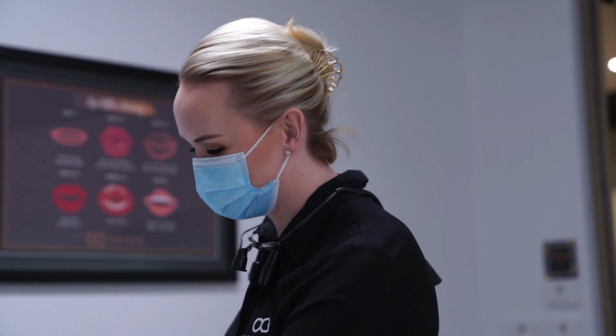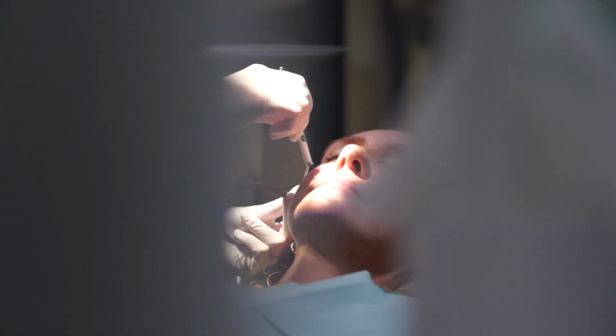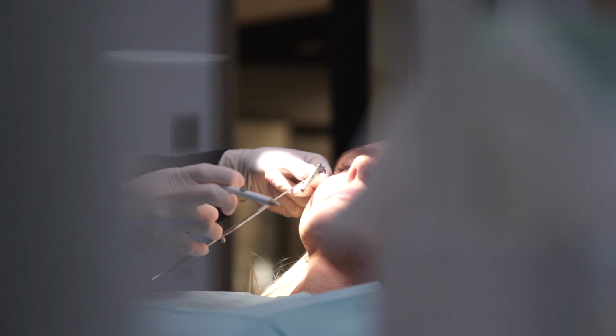By completing a preoperative facial assessment and vascular mapping, we can reduce the risk of complications when injecting dermal filler.